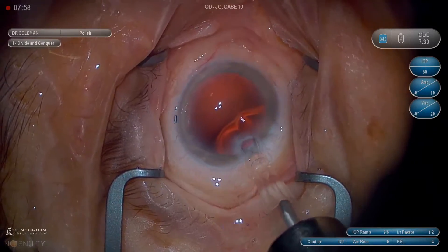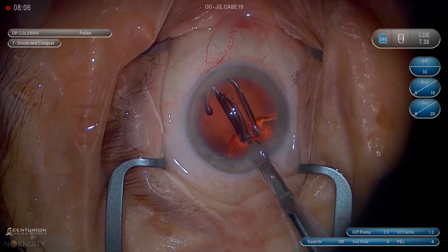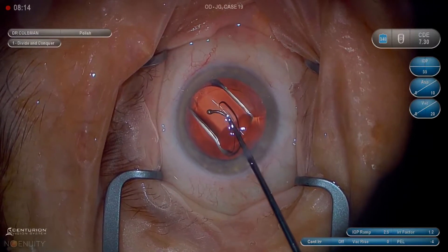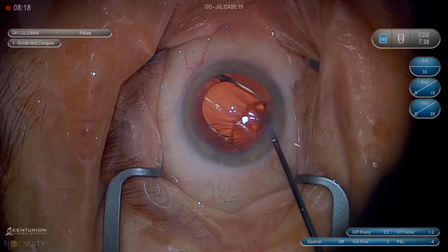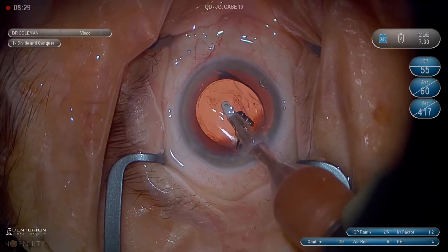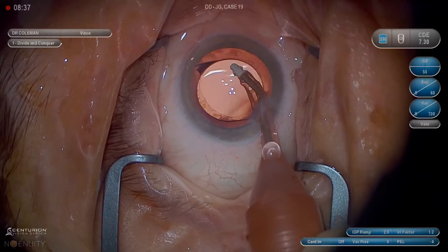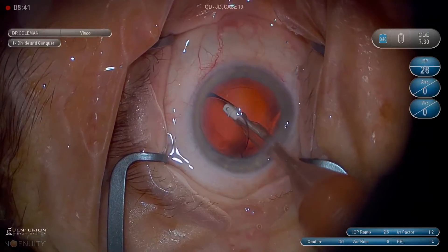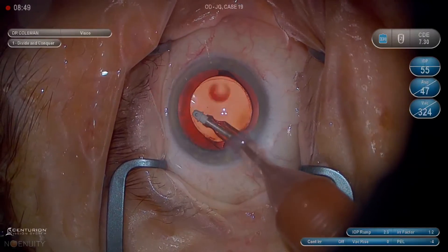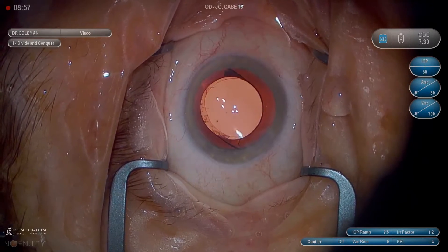I go in bevel up. I think that gives me a little more control of the eye without having to use a second instrument to stabilize. Make sure the leading haptic is in the capsular bag. I'm going to push this lens straight down with the chopper, get the haptic going out towards the equator, and make sure it's in the capsular bag. I usually remove the viscoelastic in the anterior chamber first, then slide the lens over by pushing down on it as I gently touch, and then once I can get around the edge, lift up. When using the IA tip, if we're looking down the bore of the port, it's very unlikely to grab capsule. When it's tilted to the side and we can't look directly into it, that's when we're at risk of grabbing posterior capsule or iris. Usually if we're looking straight down the bore, it's unlikely to do much harm.